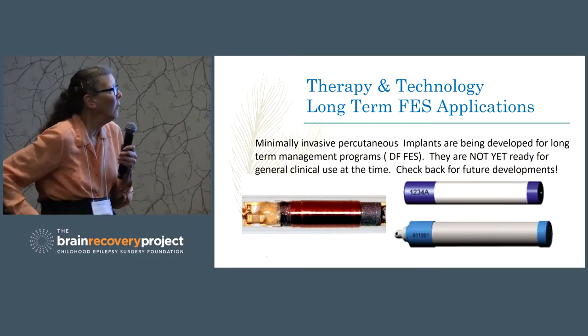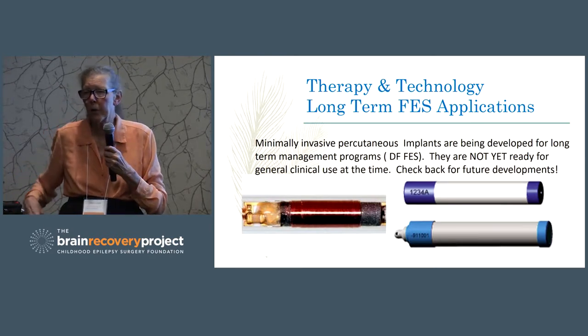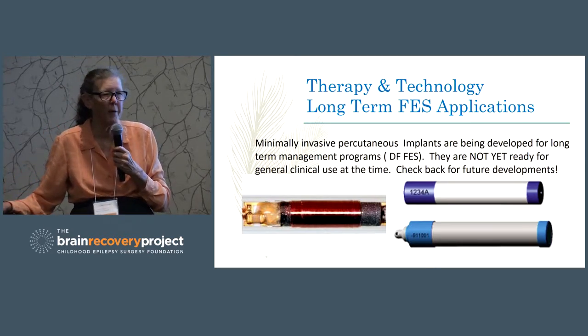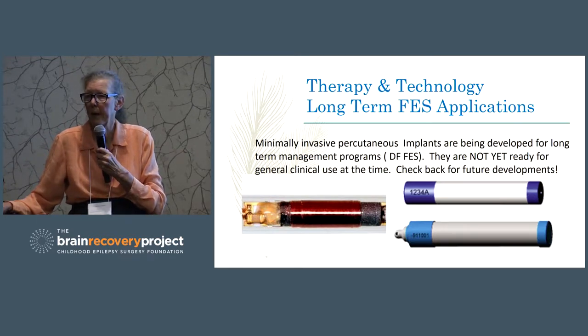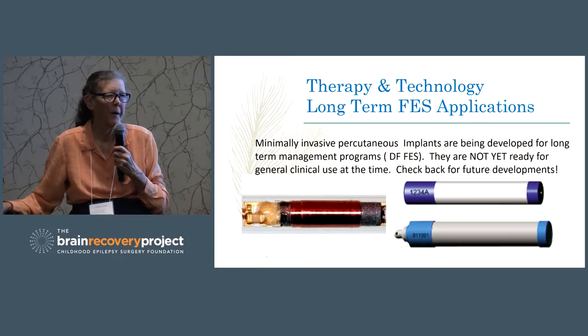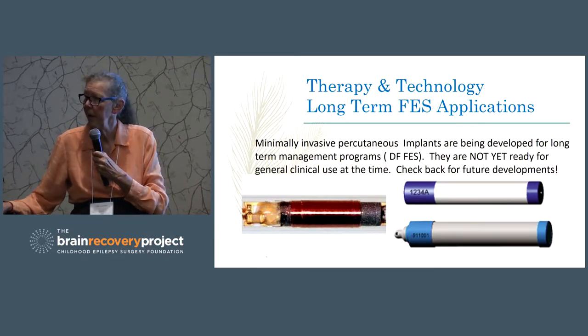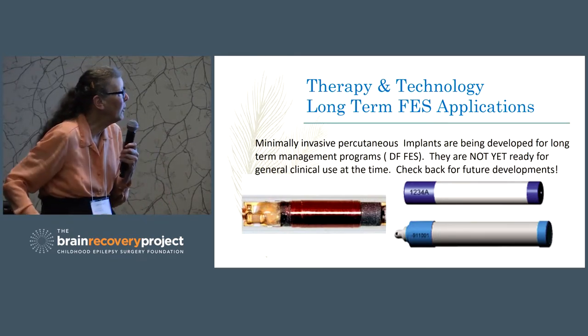right in. So basically, we've been involved at Rancho with this kind of work for probably 10 years now, and we can get 2 to 4 implants in about 20 minutes. So it's very non-invasive. Local anesthesia only, and it works very well.